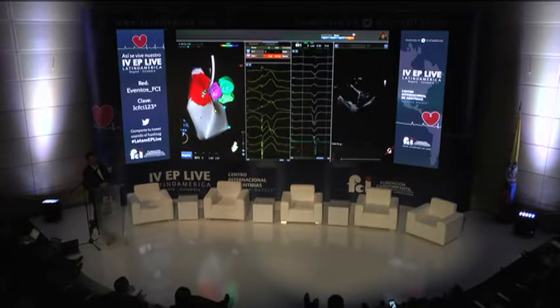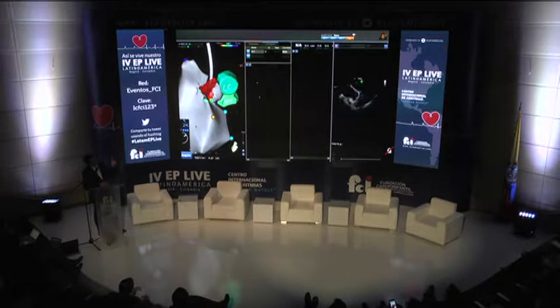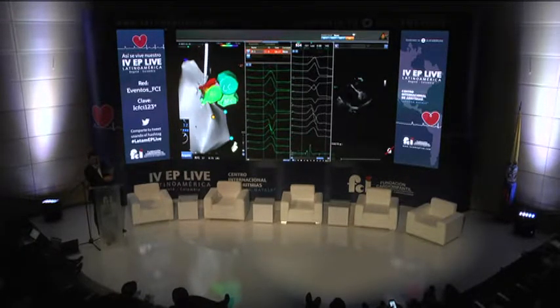Something important in echography: everything guided by intracardiac ultrasound requires you to see the tip of the needle or the tip of the catheter if you are mapping, because you can see the shaft of the catheter here, but that does not necessarily mean that the tip is over here. It can be in another cusp. It can be in the coronary as well. So with this CARTO technology, this green tip indicates exactly the green circle where the tip is located. That is pretty reliable. And with other technologies, you have to rotate from clockwise to counterclockwise.